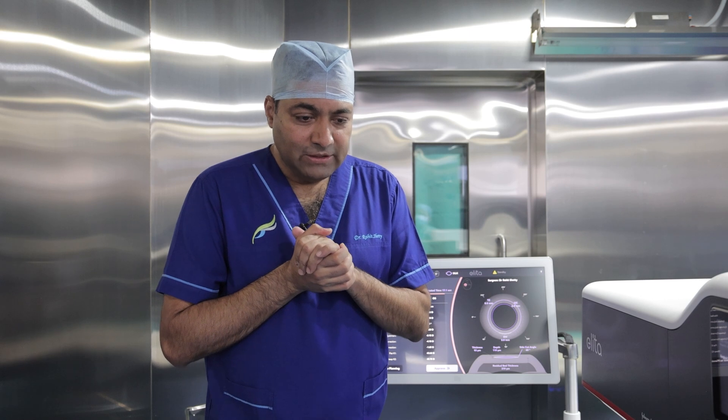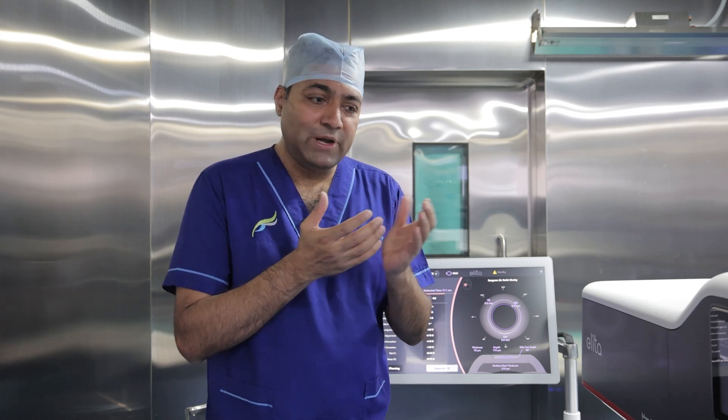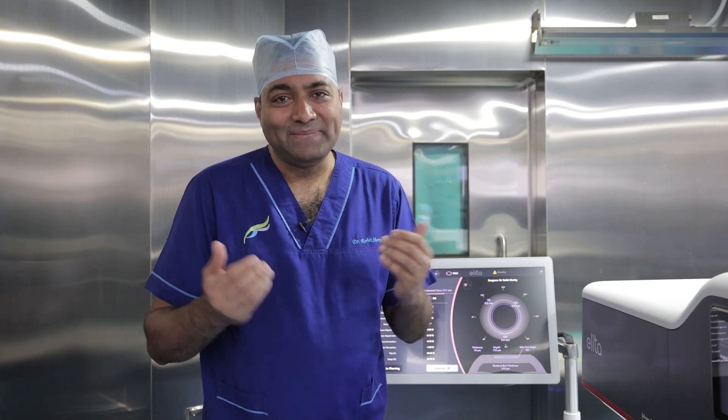Dear friends, now let's start with this procedure. Let's call our patient and see how J&J has given us this new machine and how it can help us bring the lenticule out just like SILK.